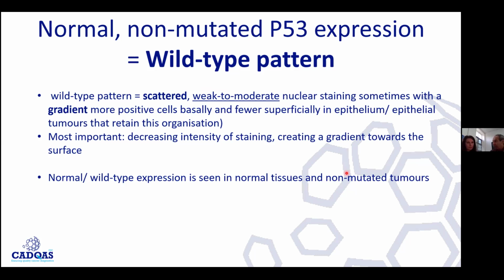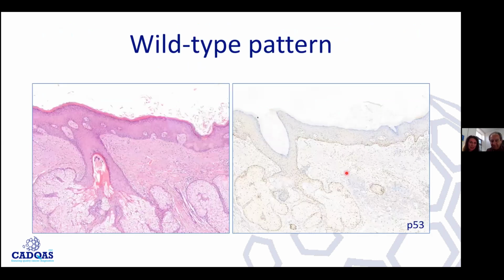So you can have wild type protein, which has implications to interpret the changes, but then the presence of a mutated protein means something in oncogenesis, in tumor evolution, perhaps in dysplasia, perhaps in grade of carcinoma, etc. Yeah. So this is the most important concept now, that for some things we should go away from counting and assess more the pattern. Luckily, yeah.